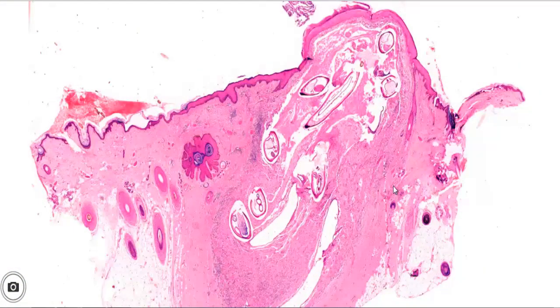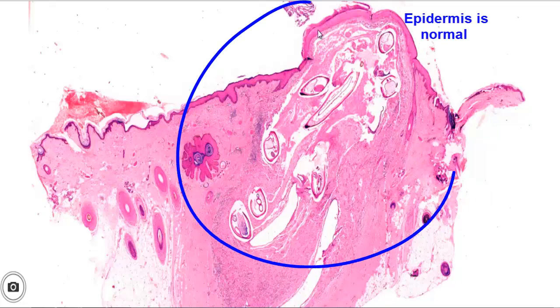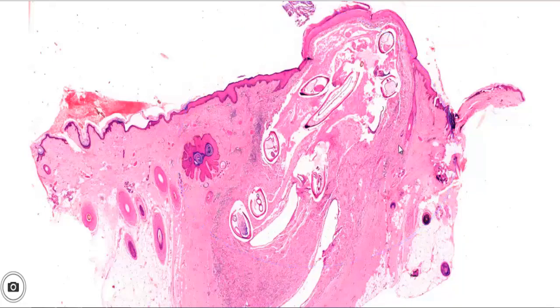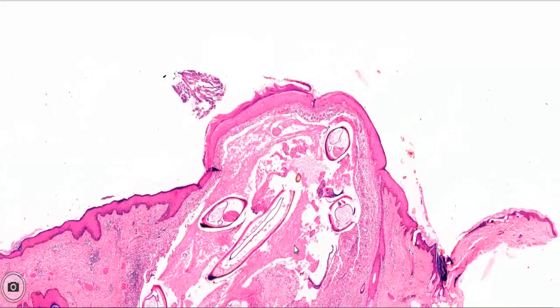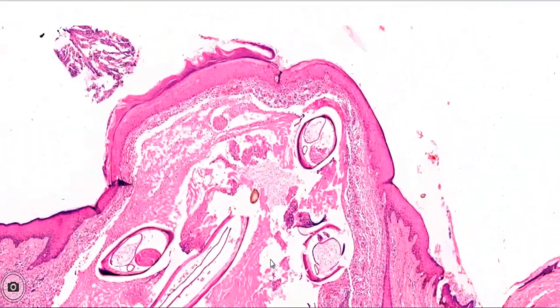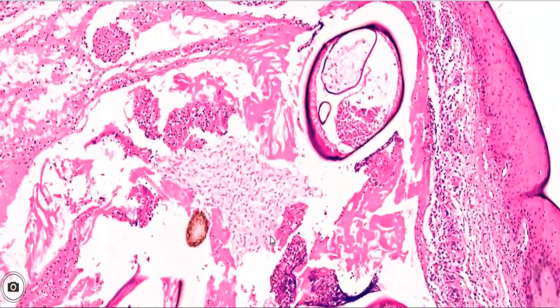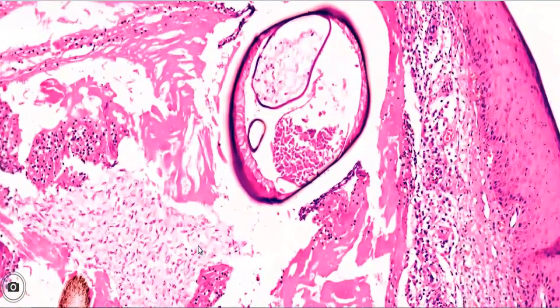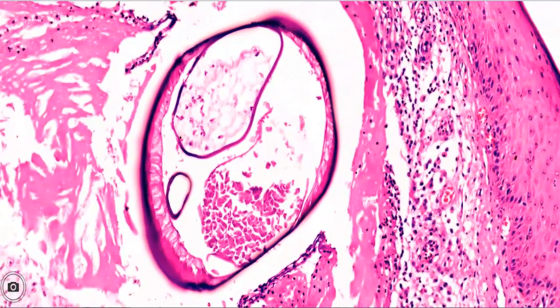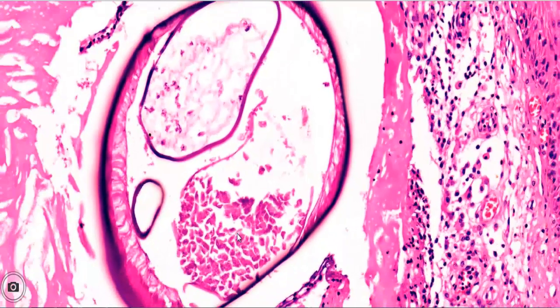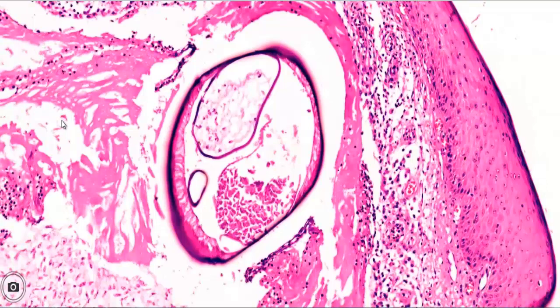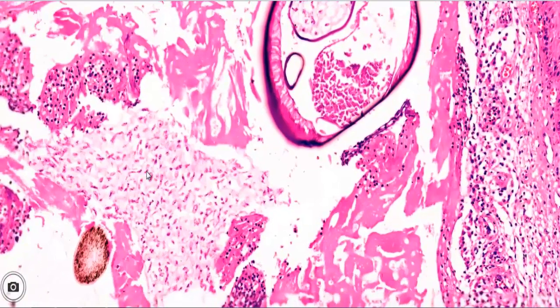Here we see that the epidermis is normal, and under the epidermis is a nodular lesion which is surrounded by fibrous tissue all around — a fibrous capsule — and inflammatory cells. Within the lesion, we see cross sections of many parasitic structures with fibrinopurulent exudate. Here we see a cross section of the gravid worm with two uteri filled with microfilariae. The characteristic microfilariae of this worm fill the gravid uterus; the uteri are generally bi-paired.